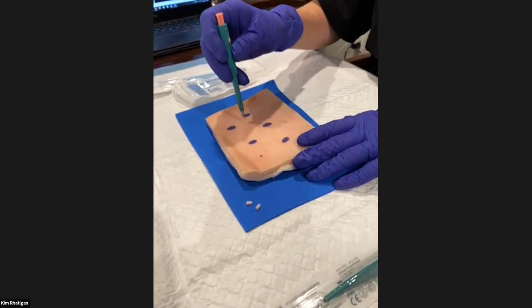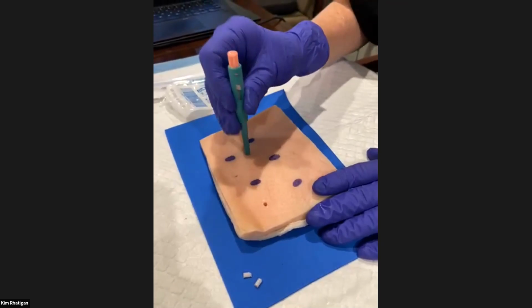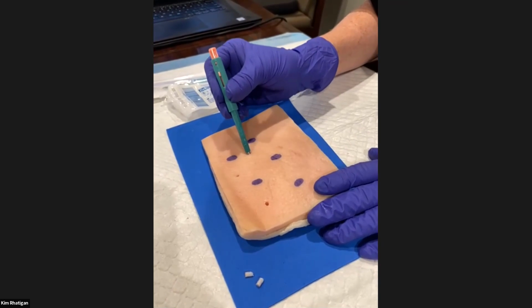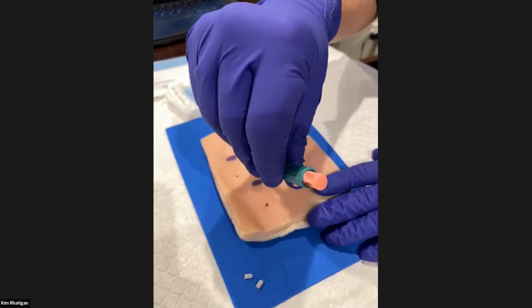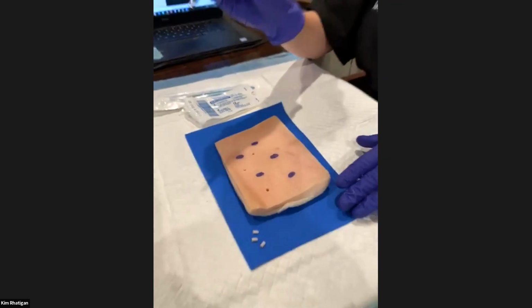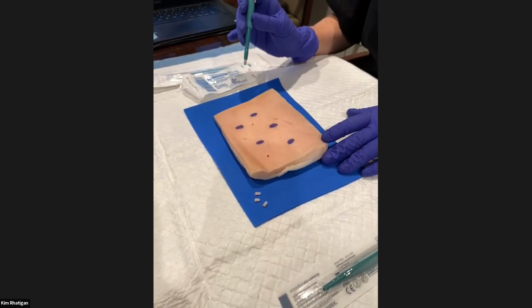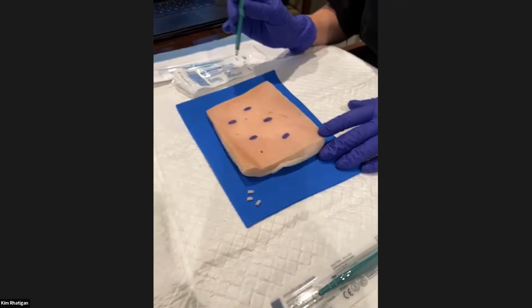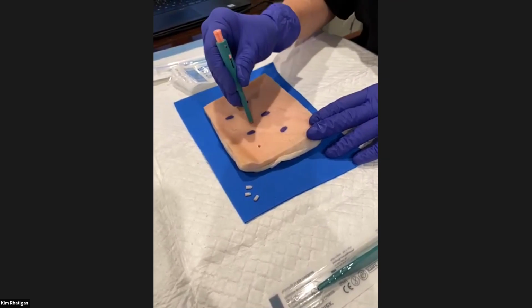Okay. So let's do another one. Want me to do one on one of the lesions? My fake lesions I can do. So I'm going to go here, twist, go across, twist. Here we go. There we are. You want me to do a few more, Dr. McClain? No, we'll give them time. If they want some time to do it, we'll give them a minute. You can do a few more if you want. I can certainly write my name, Kim, small name.